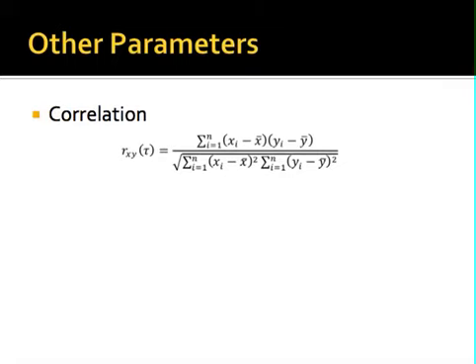Not going to talk a whole lot about wavelet coherence. Here's the issue with wavelet coherence. It's very difficult. A lot of people publish these papers and they have these beautiful pictures. Here's my wavelet coherence map of situation A and situation B, and then they draw these conclusions about how they look different. But it tends to be very qualitative.